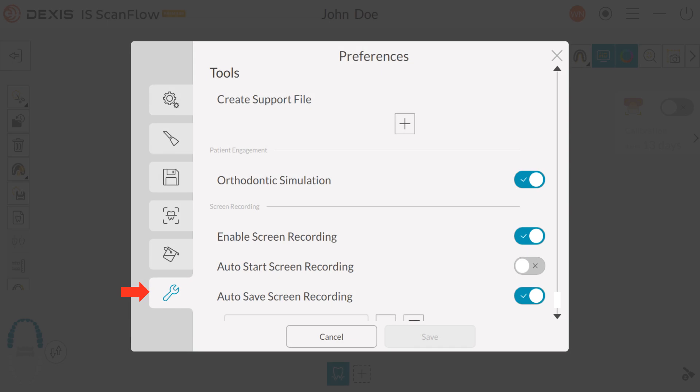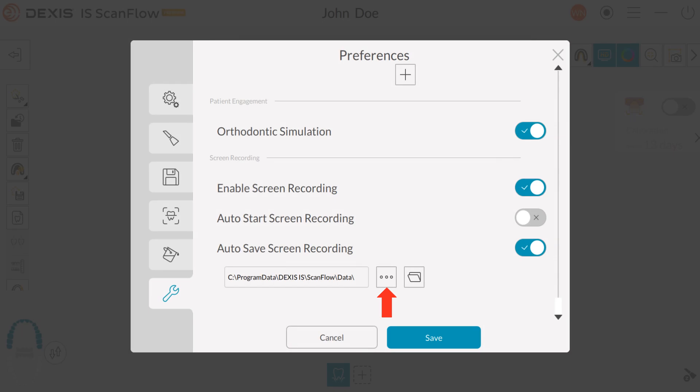Under the Tools tab: Enable Orthodontic Simulation if you want the ability to demonstrate before and after orthodontic treatment results. Enable Screen Recording is routinely enabled — this feature records up to two hours of acquisition data as an MP4 file, useful as a training aid and a troubleshooting tool. Enable Auto Save Screen Recording to automatically save a copy of the MP4 file. Click here to select where you want to save the MP4 files and click the folder to open the folder containing them. Click Save to save your preferences.